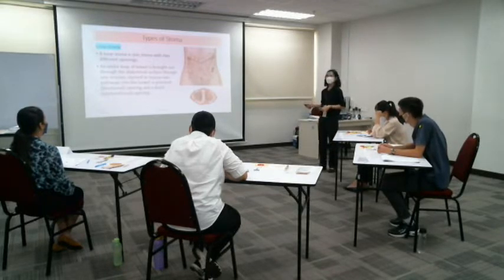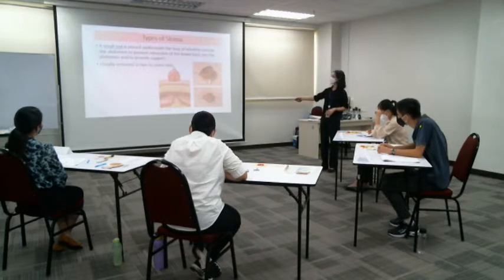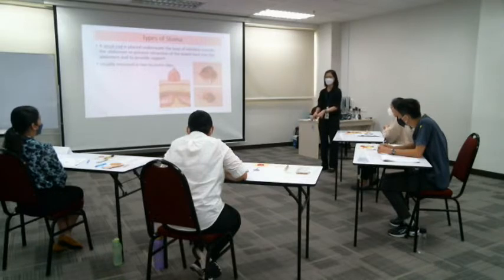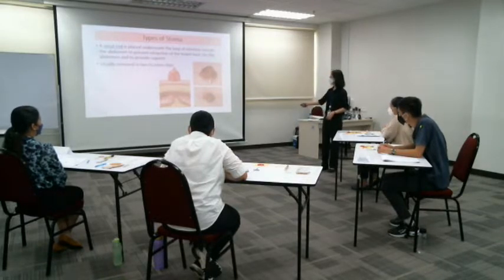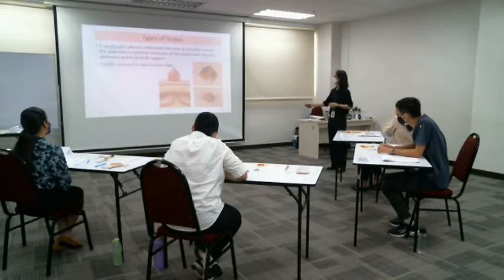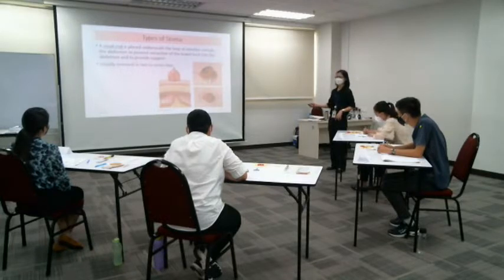Then the next thing we need to remember is that there are two openings here. Look at the pictures. The doctor brings up the part of the colon, then sews it onto the surface of the abdomen, and in between, the doctor will put a rod to prevent it from going down. This is a real picture of a loop stoma, and this small rod is placed underneath to prevent the stoma from becoming retracted, meaning going down. It usually will be removed in 2 to 7 days.